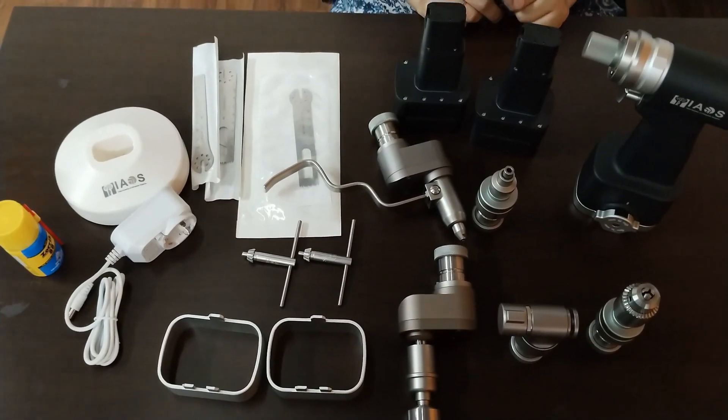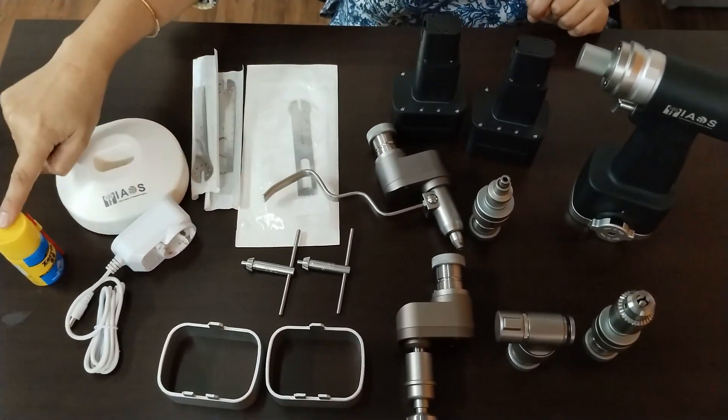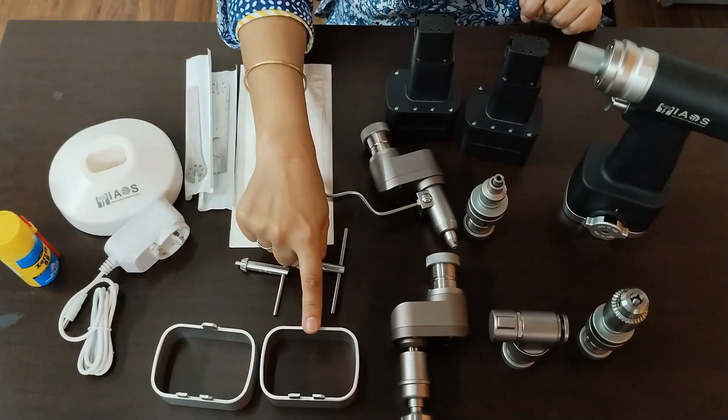This power tool comes with a handpiece, two batteries, a charging dock, a charger, lubricant, and two transfer shields.